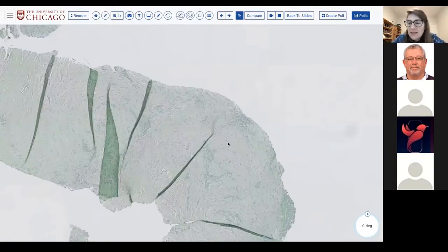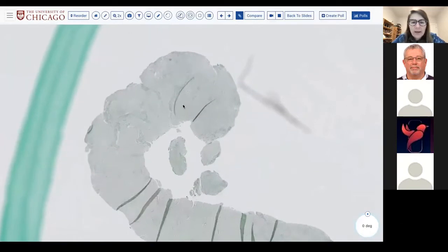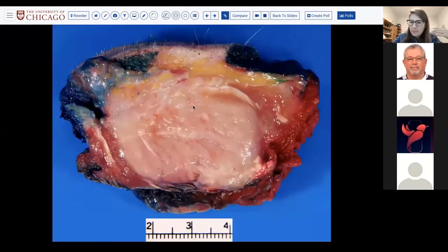So yeah, we have a diagnosis of just a plain old squamous cell carcinoma, potentially. And so I believe on core biopsy, this was called high-grade carcinoma with squamous differentiation. See long comment. But the point is, it's an infiltrative lesion. It seems to be high grade. There's a lot of desmoplasia. So that's what we want to get across.